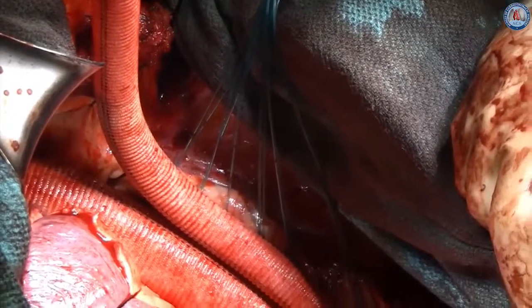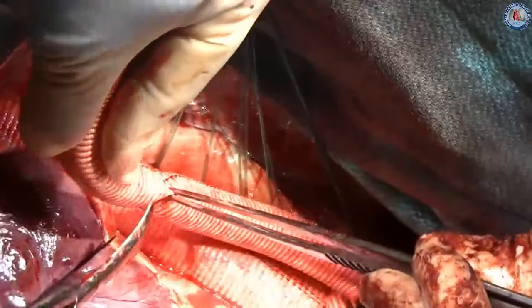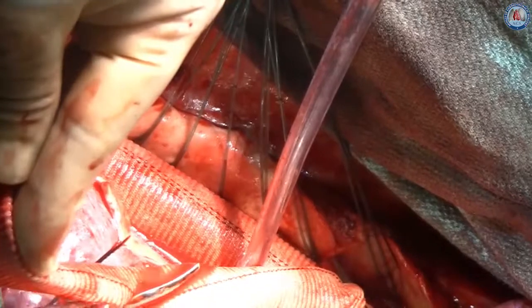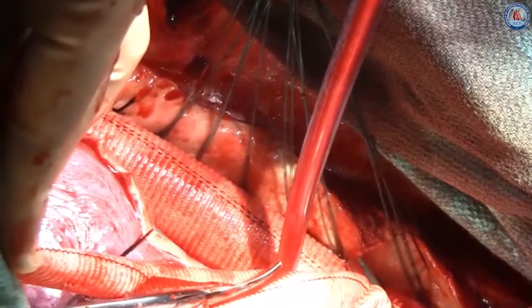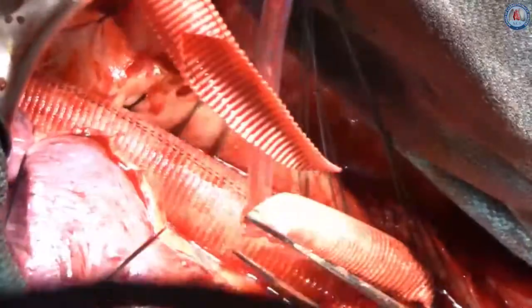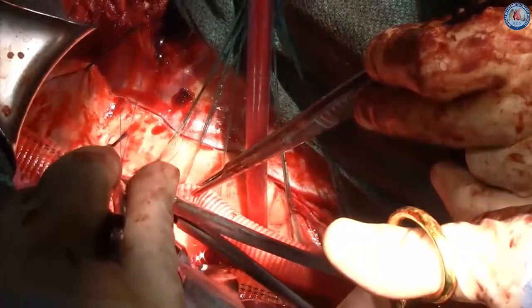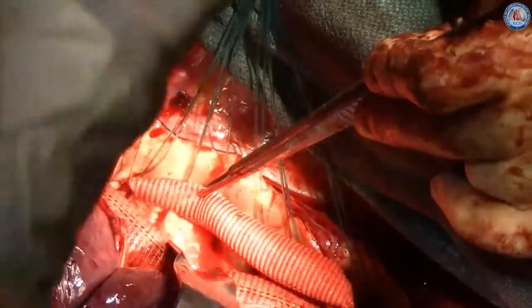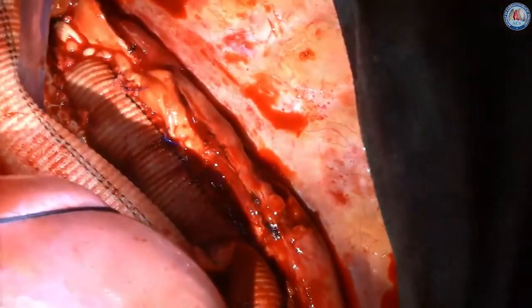The 14mm Dacron graft is now prepared for use to reattach the patent intercostal arteries T8 through T12. Even without changes in the motor evoked potentials, we believe that reattaching these intercostal arteries helps reduce the risk of delayed paraplegia. This anastomosis is performed in an end-to-side fashion using a 3-0 running polypropylene suture. Other configurations can be utilized such as the loop graft to reattach intercostal arteries, but the end-to-side was selected for this case.